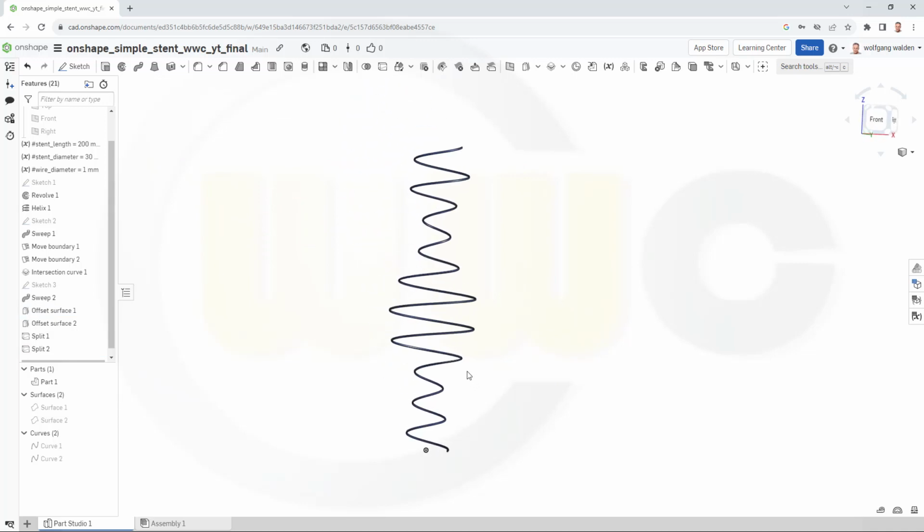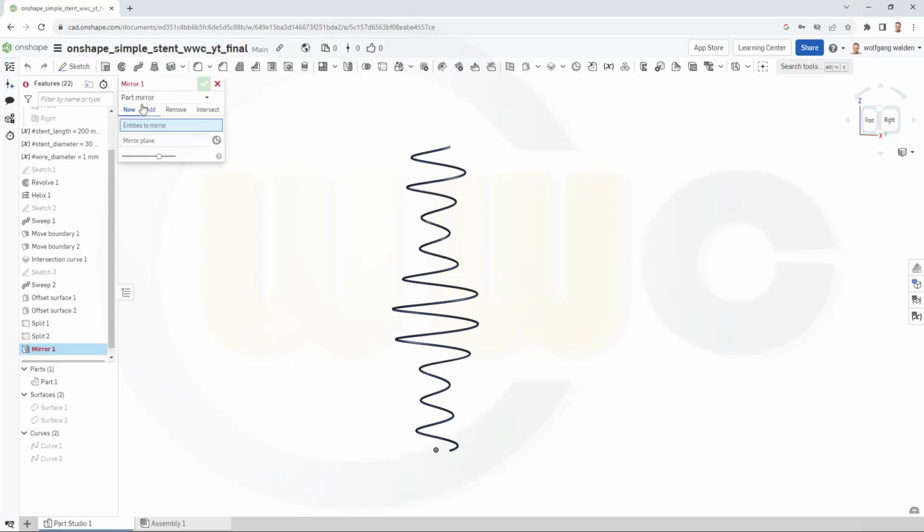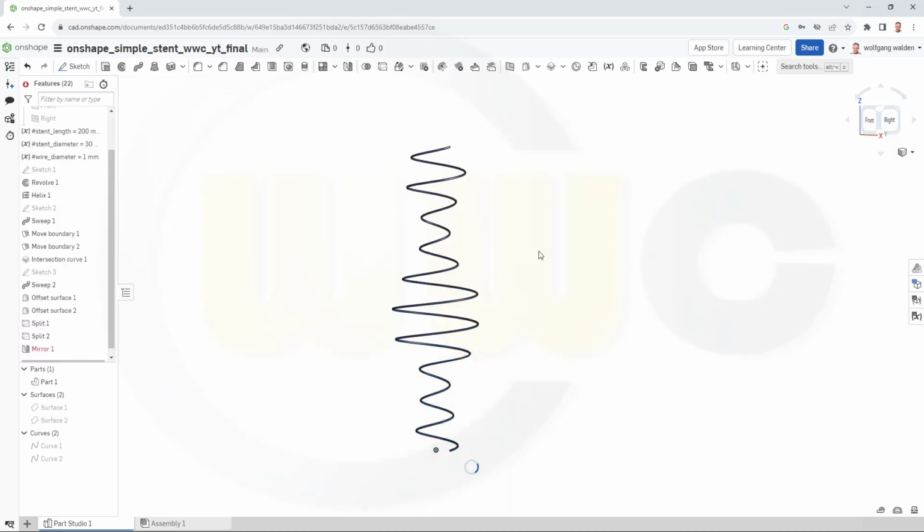Now I want to mirror that part. So go for a mirror part, mirror, that's okay. This part here, the mirror plane would be the front plane, for example. And it's a new one, yes, confirm. Takes a while. And then I want to make a circular pattern, and therefore I will need a line which is in sketch 1, so I make it visible.